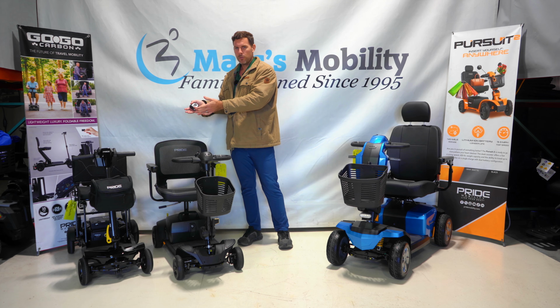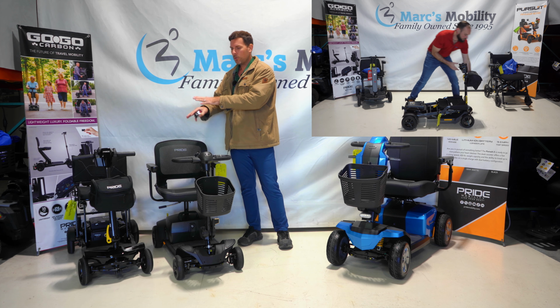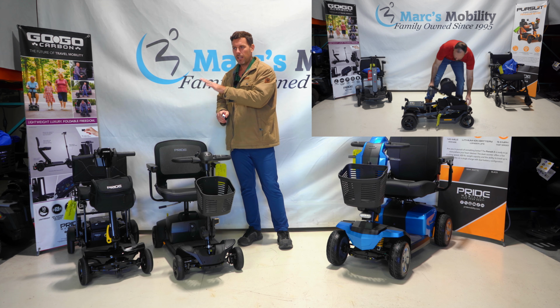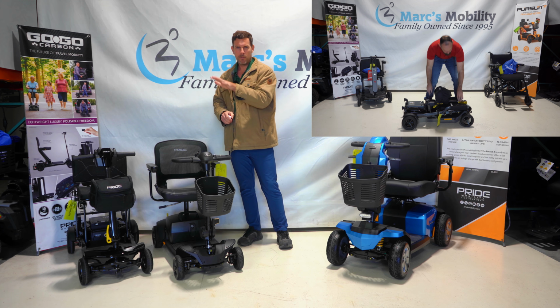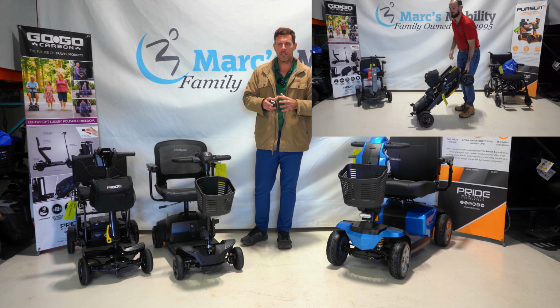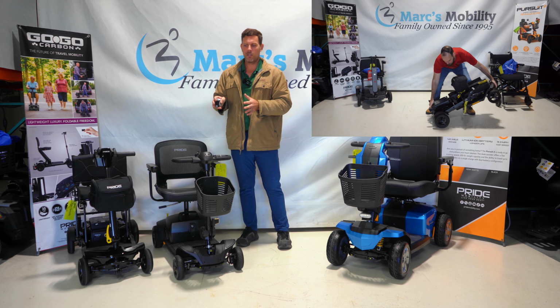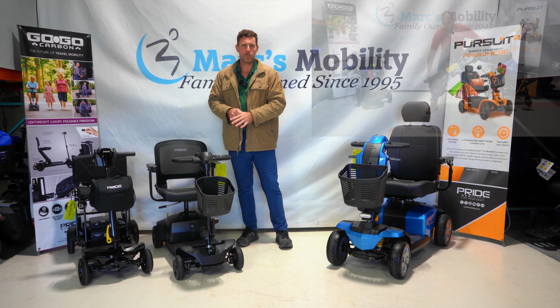the Super Portable. Now, the Super Portable is going to be somewhere in that mid 40 pound weight range. It folds all up in itself, but they do make some lighter carbon fiber folding units that might be more in that 35 pound weight range. So I mention this to you because you do have to be able to lift at least somewhere around 35 pounds for most of these units, whether it's a folding or a portable unit.